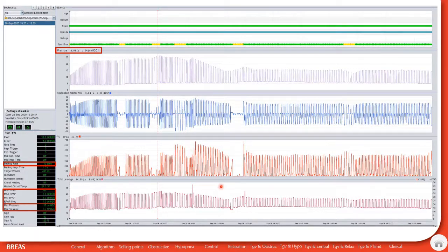Here the test lung was opened, the compliance was changed. You see that the volumes are shooting up because of the simulated compliance change, making the pressure support drop. Here again, a hypopnea with a pressure increase, pressure is decreasing, again a central apnea with the corresponding pressure changes of both inspiratory pressures as well as expiratory pressures.